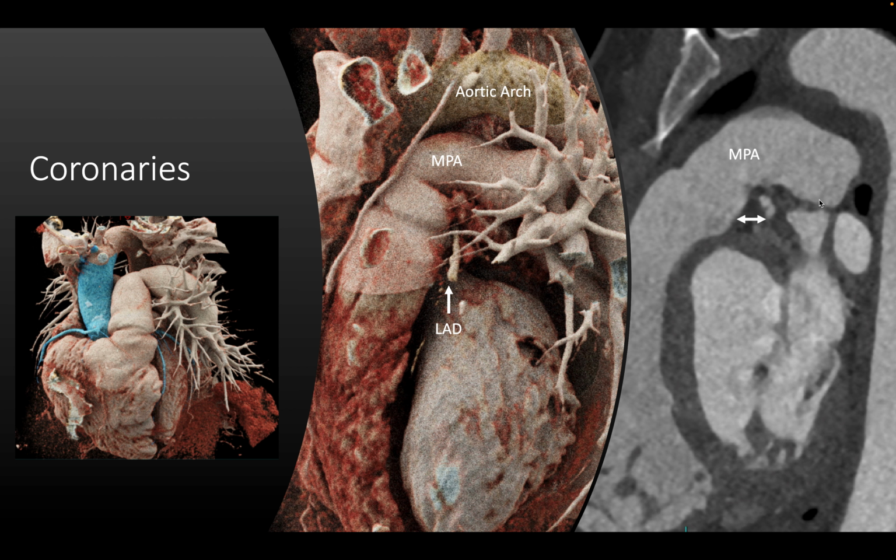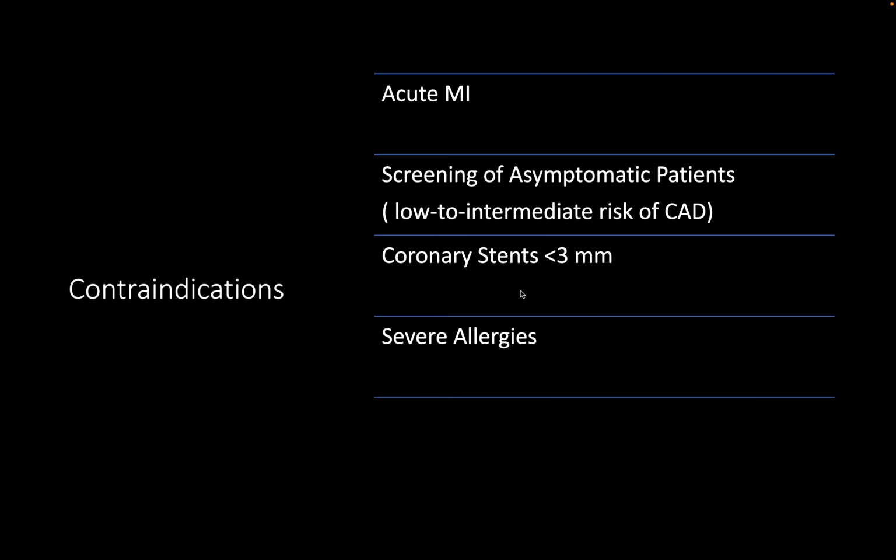Sometimes, not only in coronary artery disease, but also in detection of how far the coronary is from the pulmonary valve or from landing zones for a potential percutaneous solution. So again, that would be important to understand how far the coronary artery is from a potential landing zone.